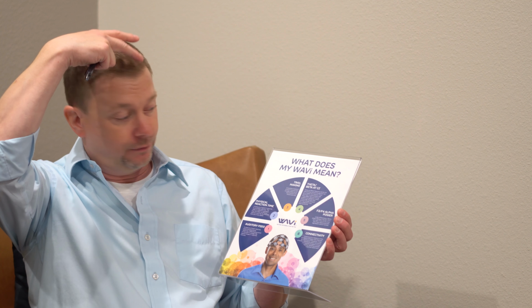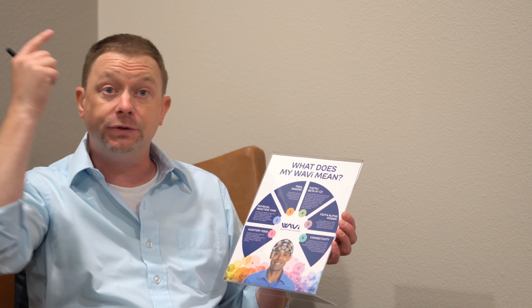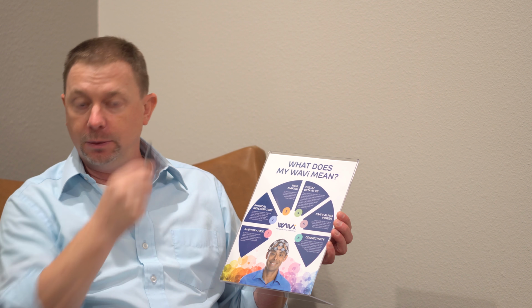The 5th one, next to last, is the F3, F4 alpha power. The F3, F4 alpha power is a description of the frontal 3 and the frontal 4 power levels, which has to do with how much alpha waves are coming out of the left hemisphere versus the right hemisphere. Now, the left hemisphere is often involved in depression and balancing motivation, and the right hemisphere is involved in anxiety. So these are the approach avoidance hemispheres.